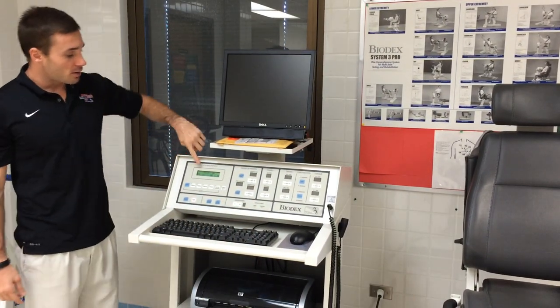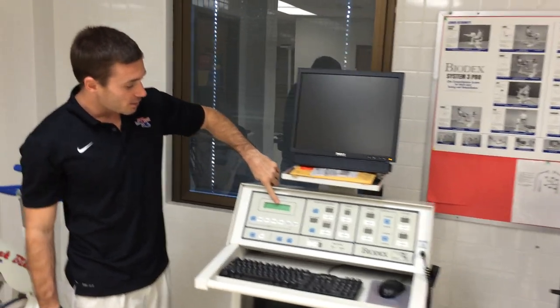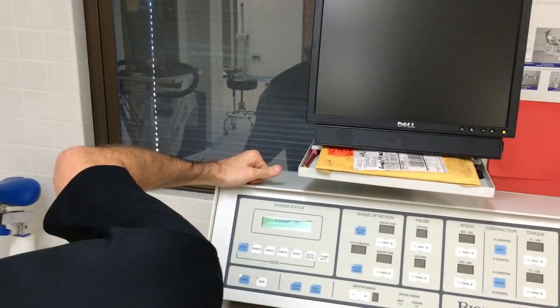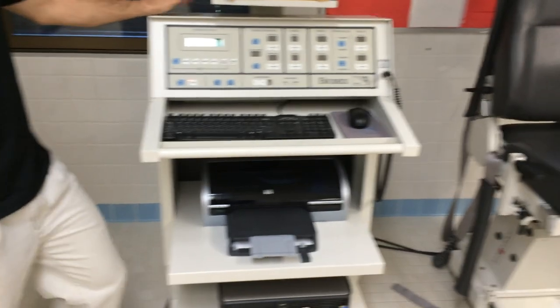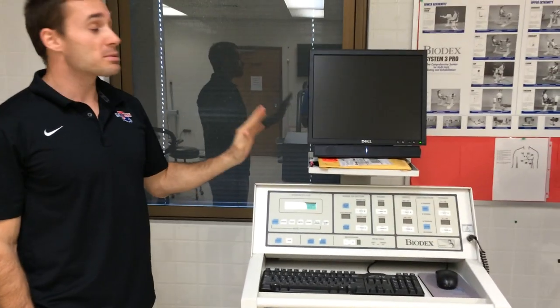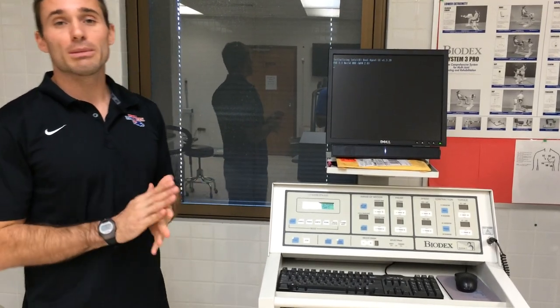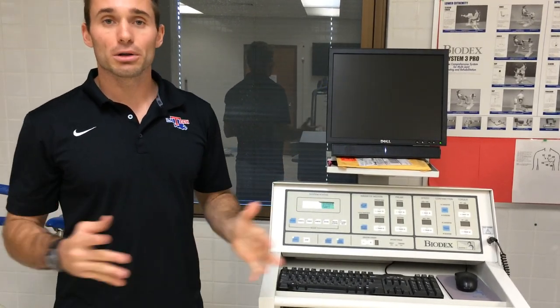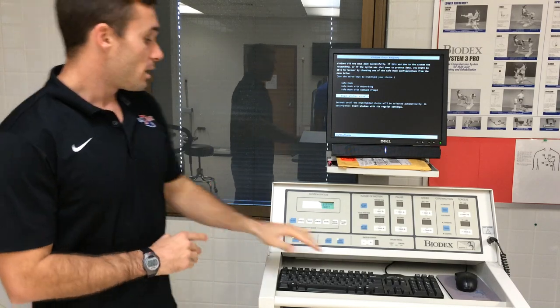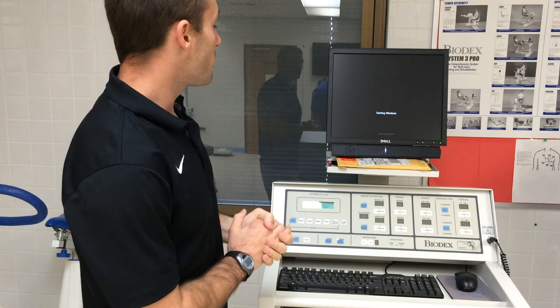After we've turned the computer on, we'll see power up here on the screen. At this point, we can turn our computer on, and everything is slowly starting to load up. Now, the nice thing about the Biodex is, unlike a lot of the equipment we have here in our lab, it warms up very quickly, actually 30 seconds to a minute, so we don't have to worry about coming in early and turning everything on. We can turn it on usually when our subject gets here. So we make sure that everything gets turned on, we move forward.